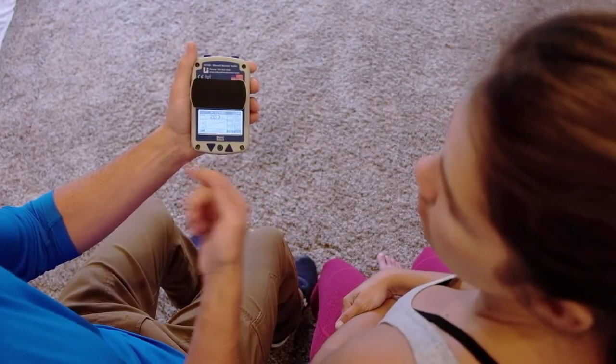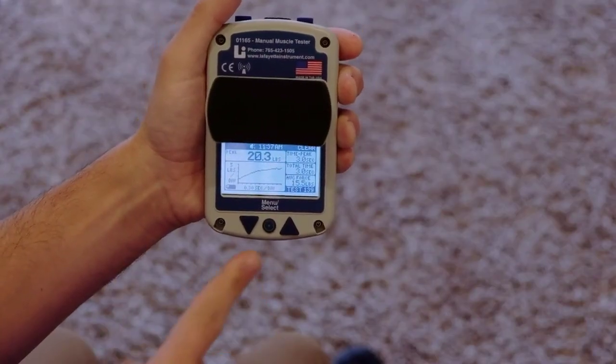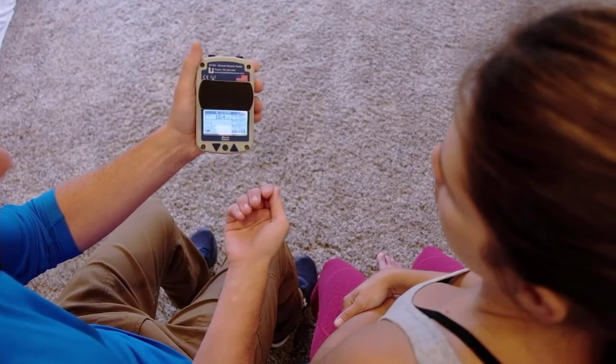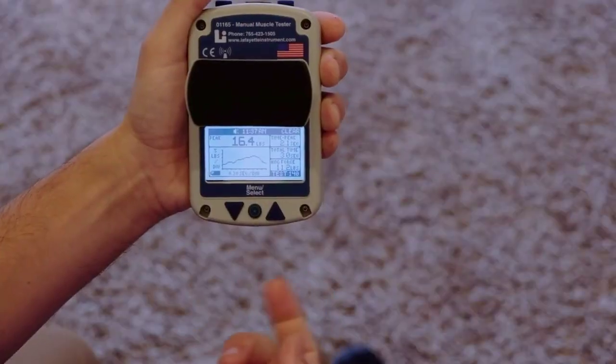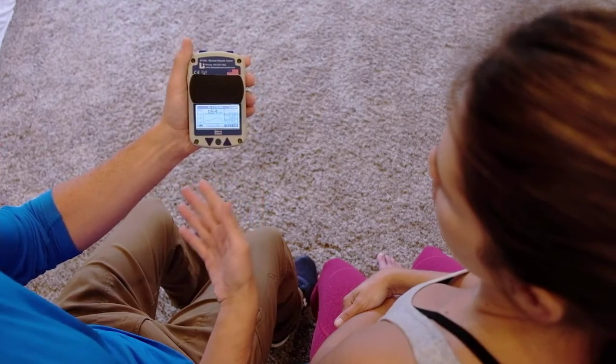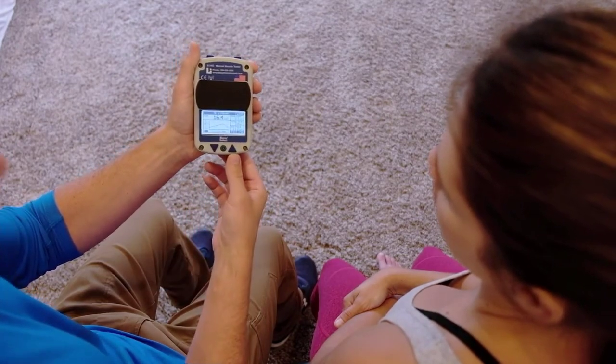So here's your right arm, 20.3 pounds, and you can see that the force was generated pretty consistently along the graph. And here's your left arm, 16.4 pounds, and look at the ups and the downs along the graph. It shows that that force was generated very inconsistently by the muscles.